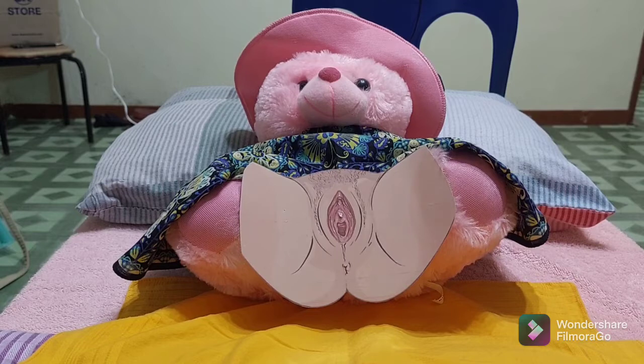So for our female patient, I'm going to get a washcloth, wet it and make a mitt. Then I'm going to apply soap onto it. Using the rule of sevens, I am going to first wipe the labia minora, which is the inside.